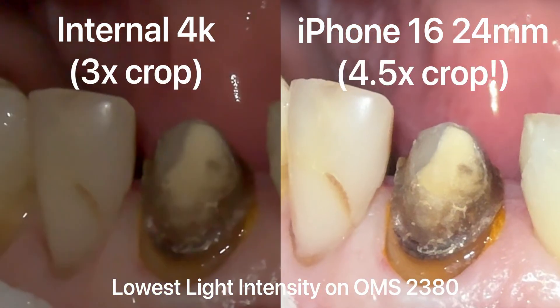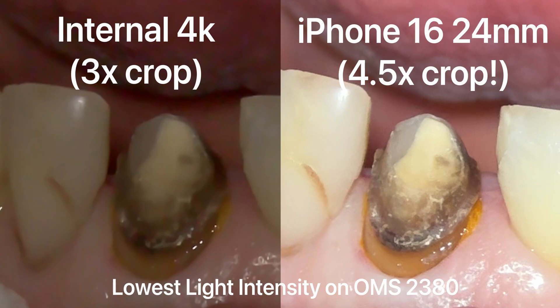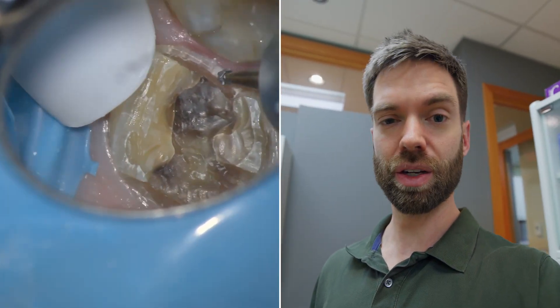For 95% of people, the internal camera is absolutely going to blow you away and be more than you'd ever need. As an educator, I do find there are certain situations where it doesn't provide what I want — specifically composite. If I'm restoring composite, I don't want to use a curing filter. I like to turn the light all the way down on the microscope, and that's when the internal camera starts to struggle a little bit. You start to see artifacts; there seems to be an overaggressive internal noise reduction happening.